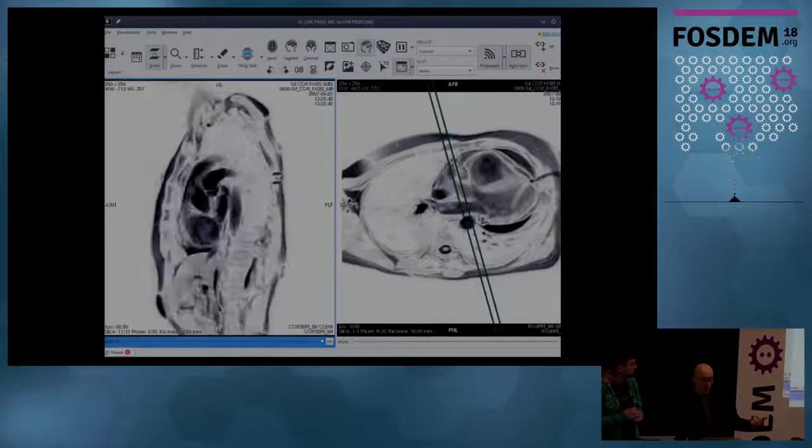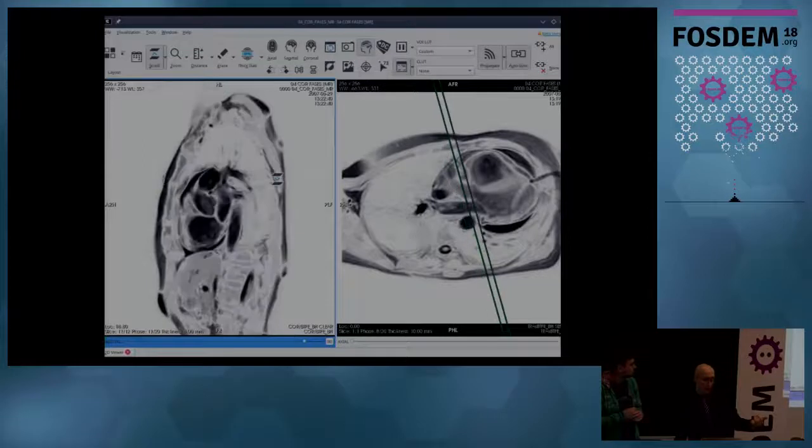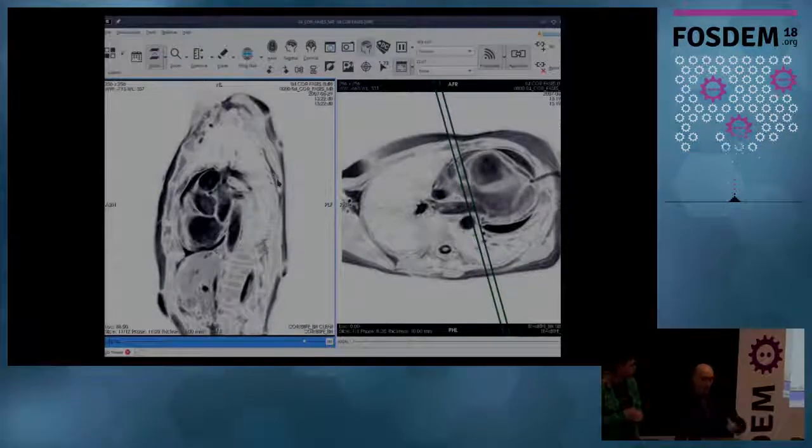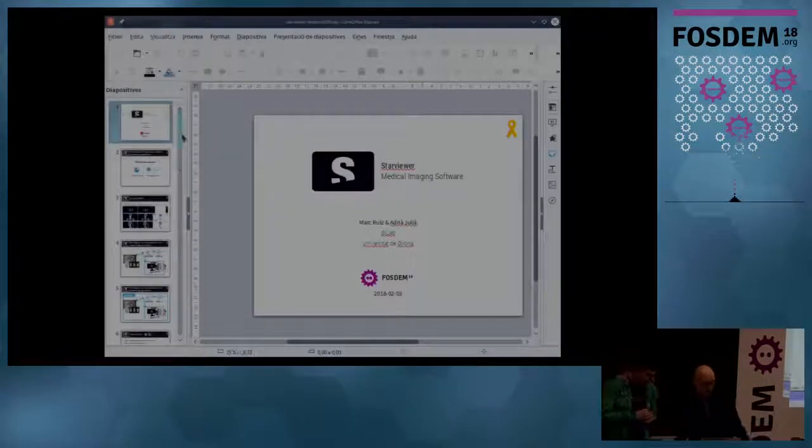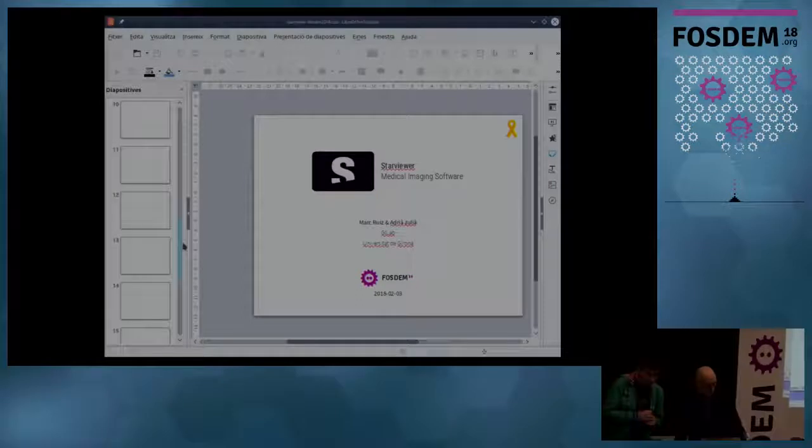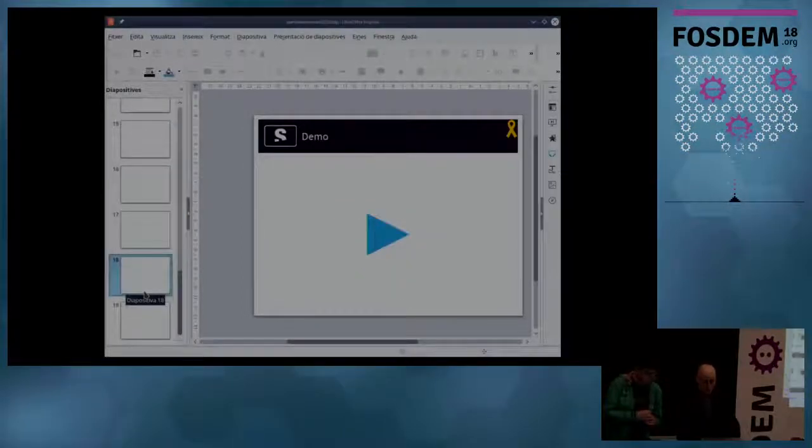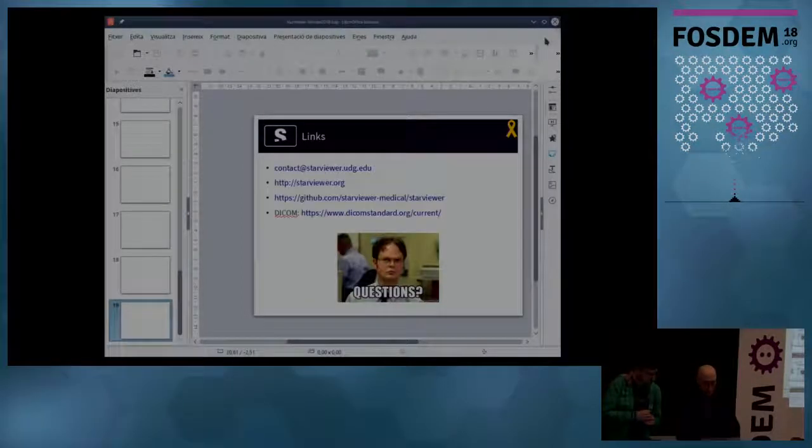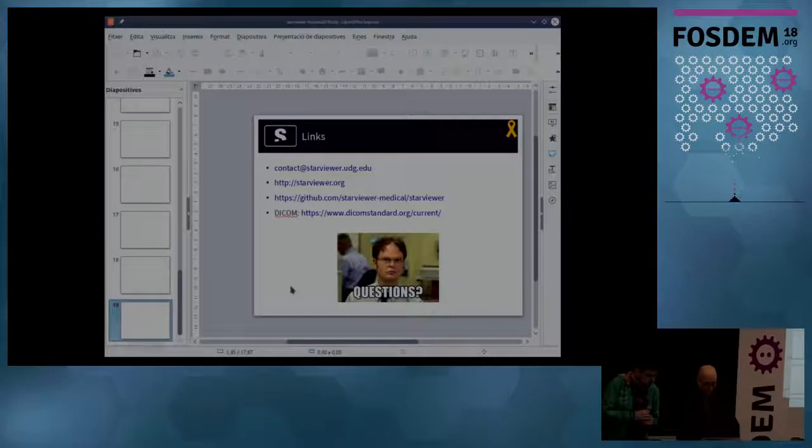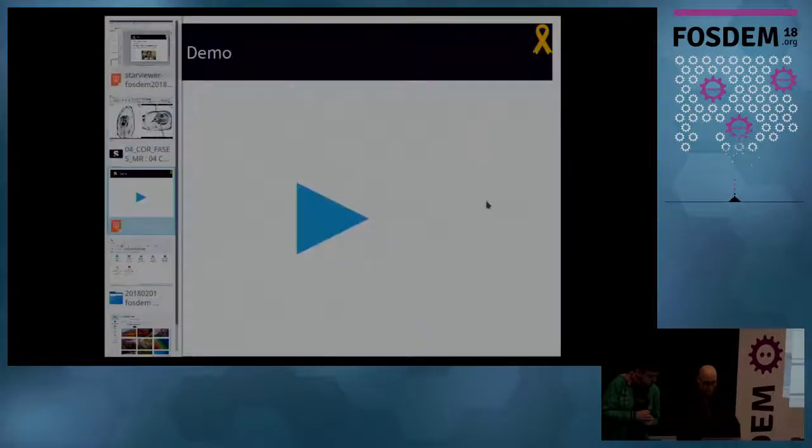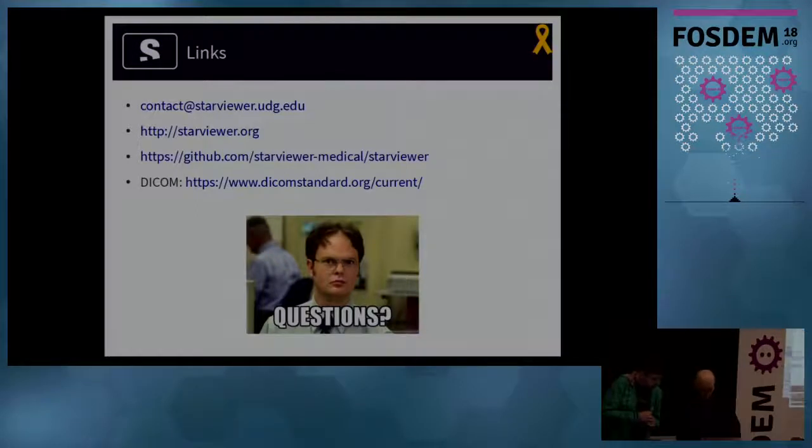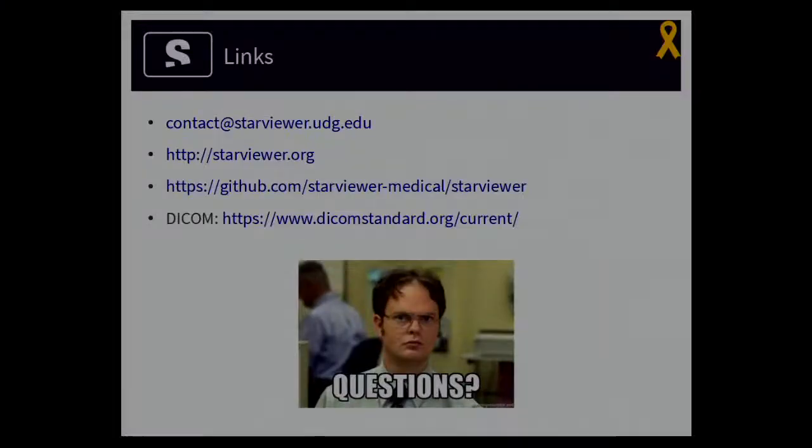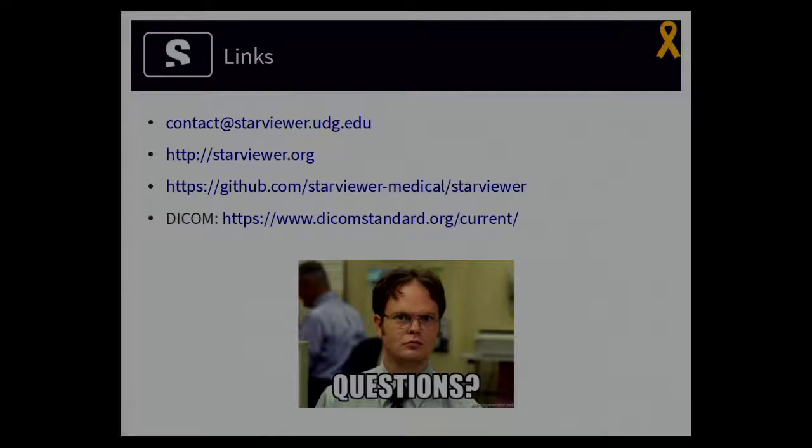And this is 3D. I am slicing, I am changing the viewing plane, and this is moving. Well, here ends our demonstrations. You can find, contact us with this mail, and you can find us on GitHub. And if you have any questions.